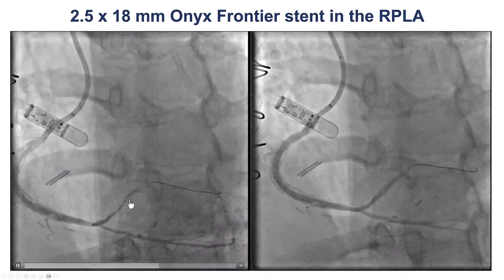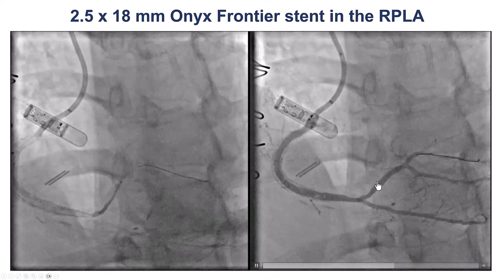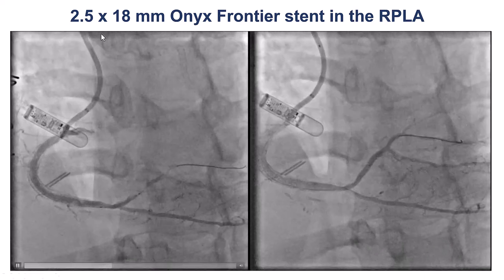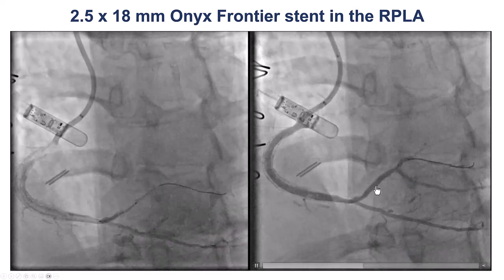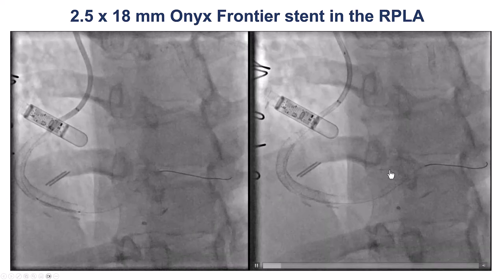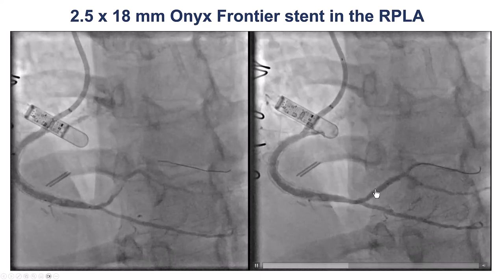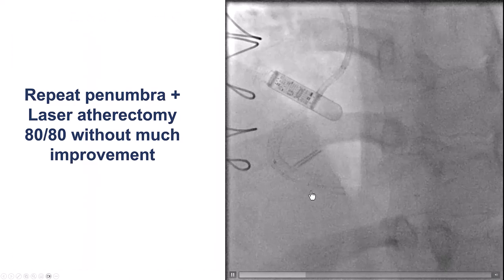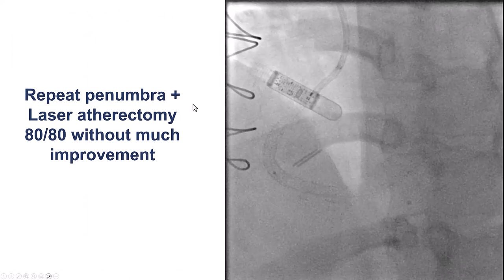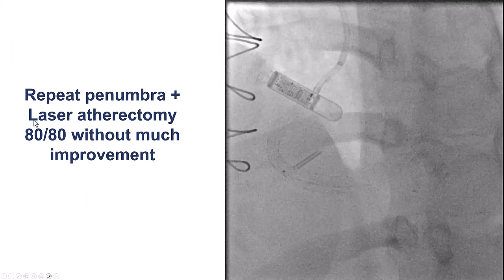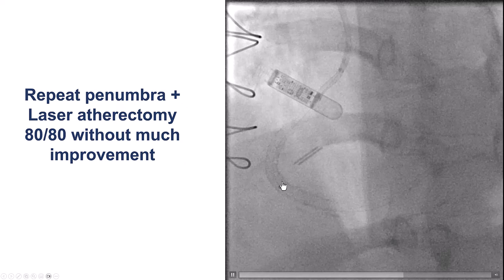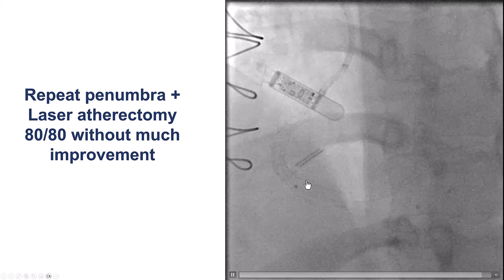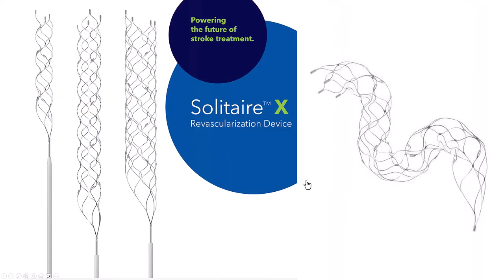There was still poor flow into the posterolateral. An area appeared to be more of a lesion, so we placed a 2.5 by 18 millimeter drug-eluting stent, which restored good flow into the right posterolateral. But we still had the filling defect in the distal RCA. We did more Penumbra aspiration and also laser, since laser can sometimes burn and vaporize thrombus — unfortunately it did not work in this particular case.